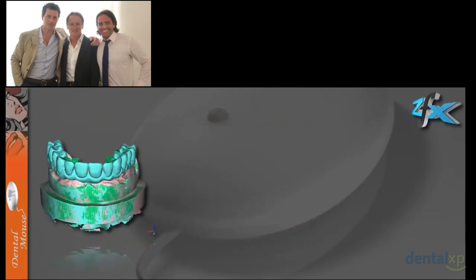And you see here that once our prosthodontic project, which has to be first tried in the mouth as we did, has been scanned, you see here on the left side it can be superimposed with the implant position and implant inclination.